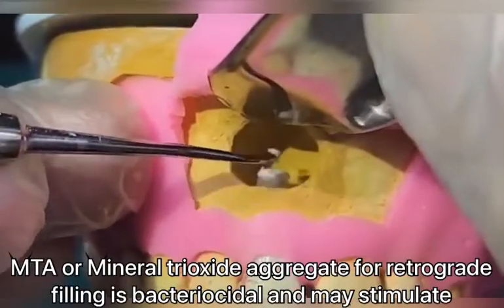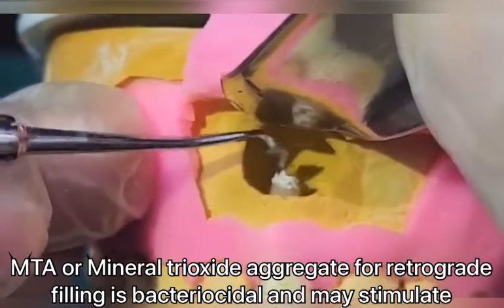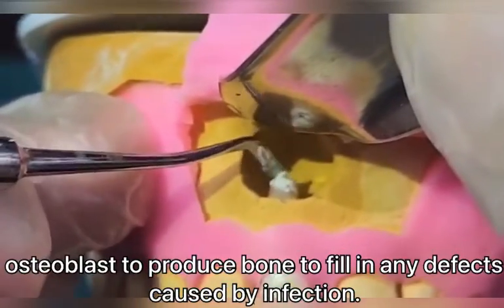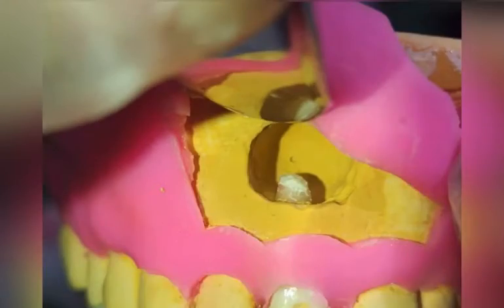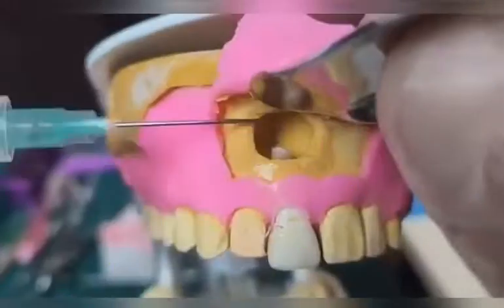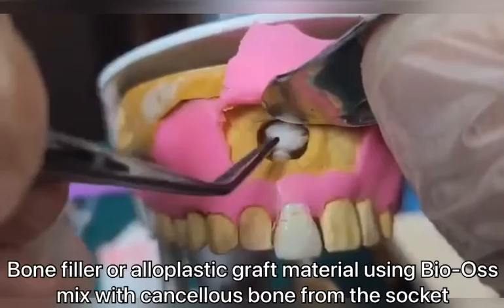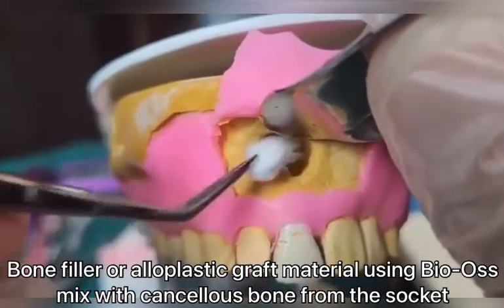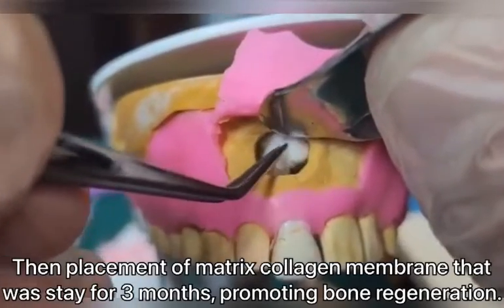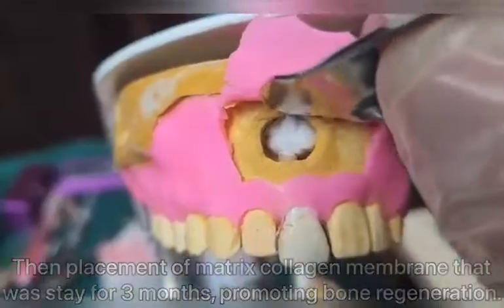MTA or mineral trioxide aggregate for retrograde filling is bactericidal and may stimulate osteoblasts to produce bone to fill in any defects caused by infection. Bone filler or alloplastic graft material using Bio-Oss mixed with cancellous bone from the socket, then placement of matrix collagen membrane that will stay for 3 months promoting bone regeneration.